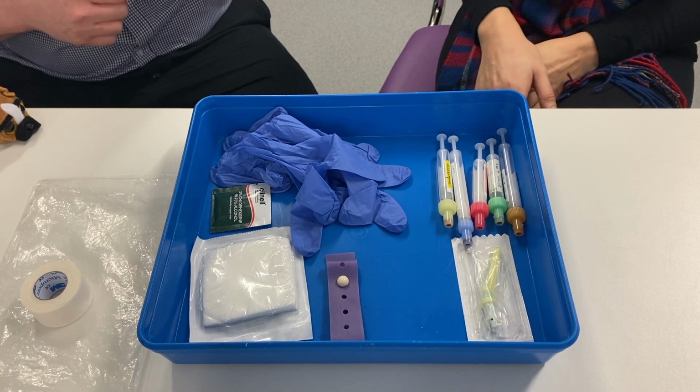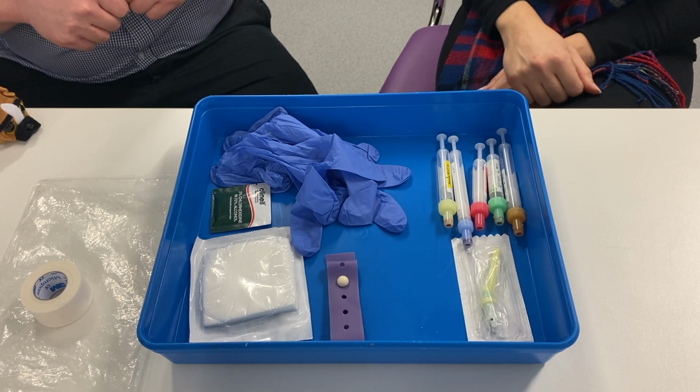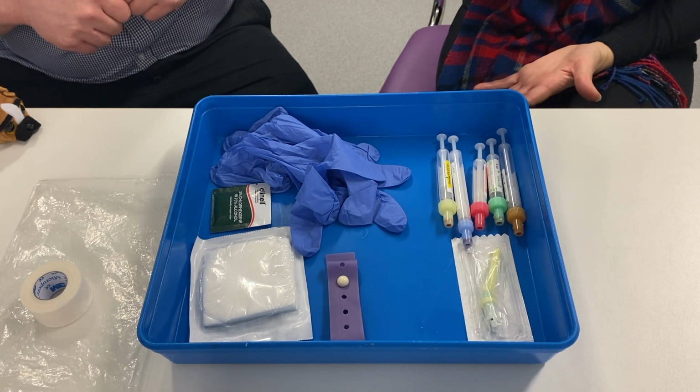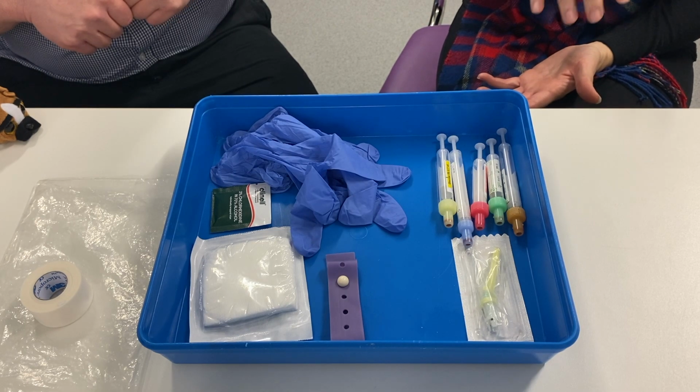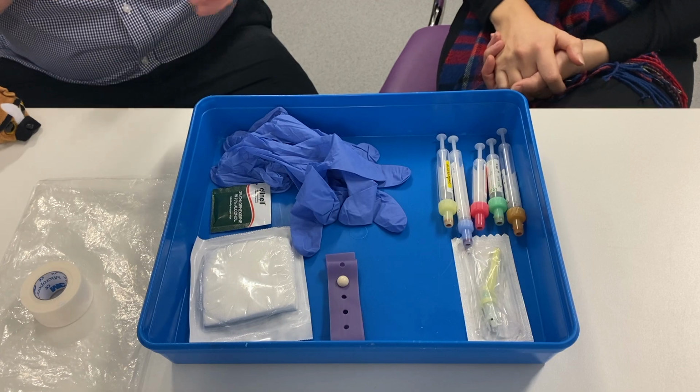It's really important to obviously wash your hands first and give your tray a good clean. They normally sit in piles on the wards, and don't presume that the person before you's cleaned it, so just give that a really good clean. And there's wipes around on the wards for you to be able to do that.